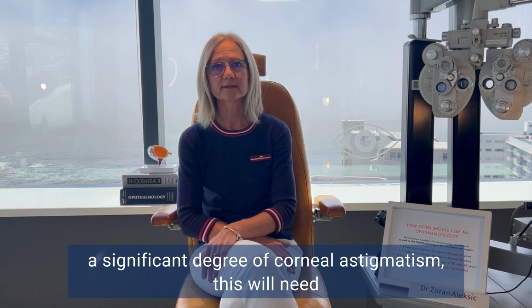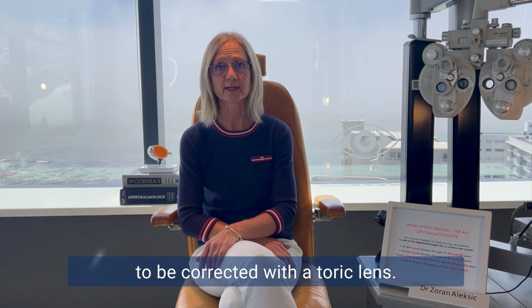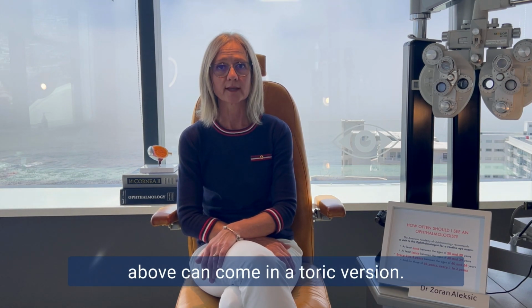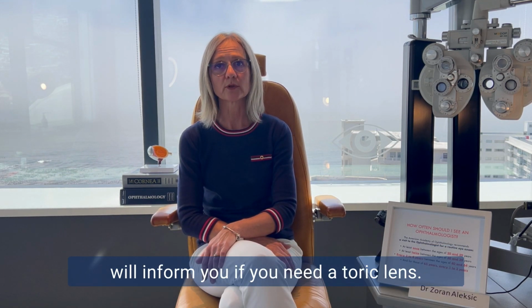If you have a significant degree of corneal astigmatism, this will need to be corrected with a toric lens. All three of the options explained above can come in a toric version. After we have done all your preoperative tests, we will inform you if you need a toric lens.